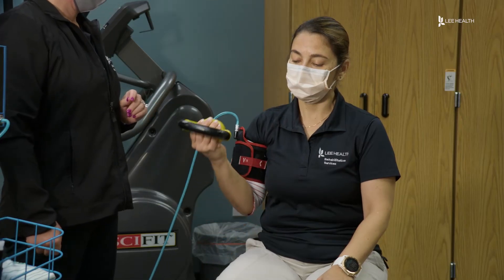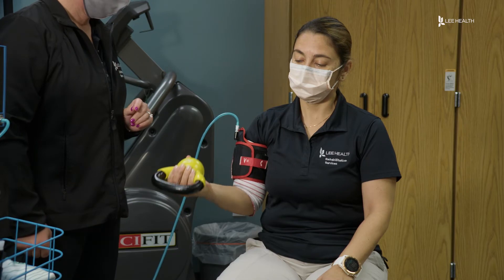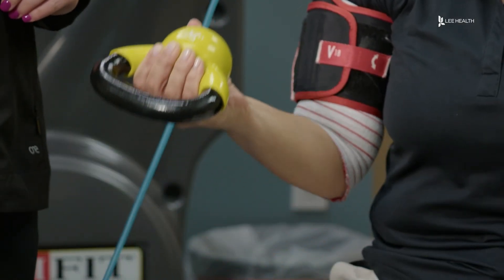The machine tricks your brain so it feels like you're lifting more weight than you actually are. It's going to feel pretty heavy. So if you needed to lift 20 pounds, I would take you down to about 8 pounds. Our brain is going to think that we're causing damage to the tissue, but we're not actually damaging the tissue because we're only working out at about 20 to 30 percent of our maximum weight.